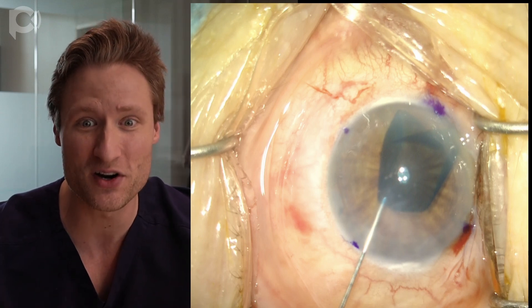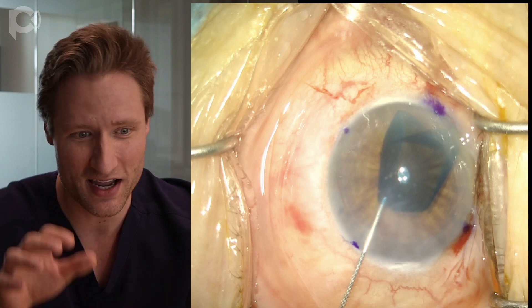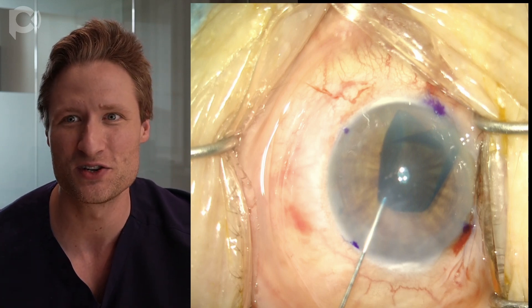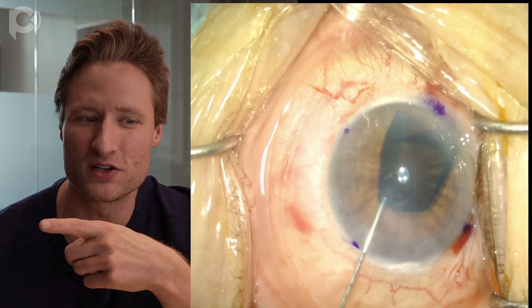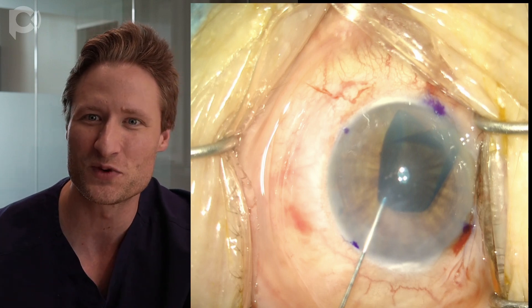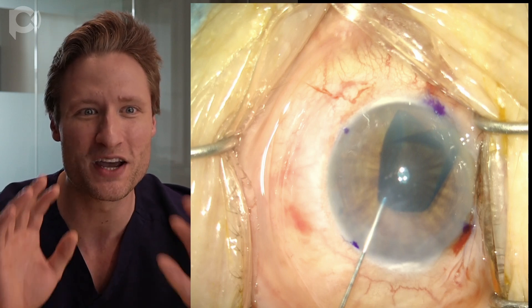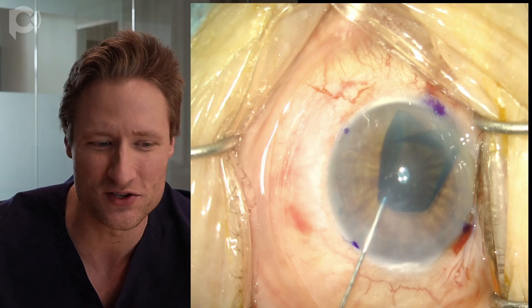You deepen the chamber and look at the orientation of the curls. The curls should be up if the graft is right side up, and curls are down if the graft is upside down. Garrett Melles' brilliant observation is what's called the Moutsouris sign — you put the cannula on top of the graft and maneuver it over into the curl to see if you can engage with it. If the curl is right side up, it'll interact with the cannula; if upside down, the cannula will be on top of the curl and you won't be able to interact with it.